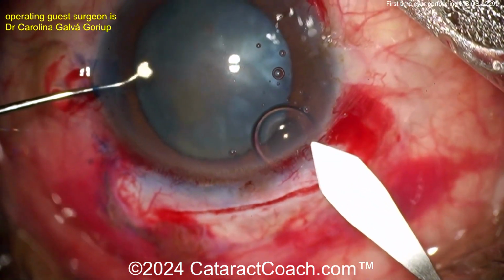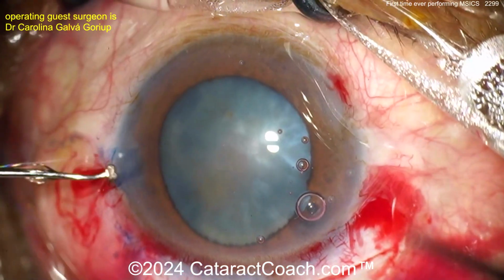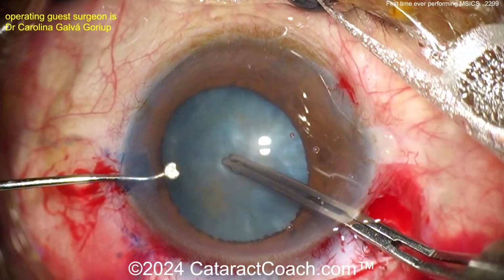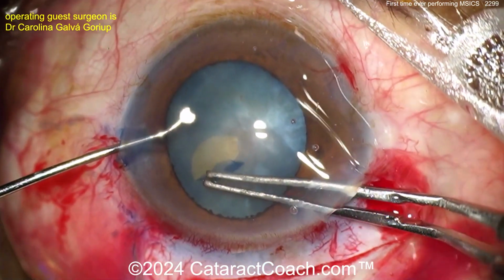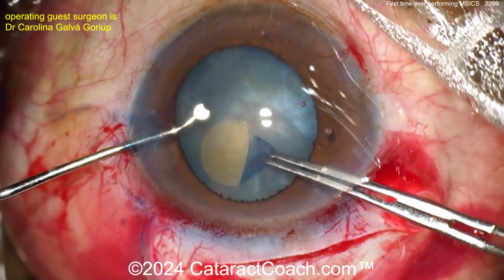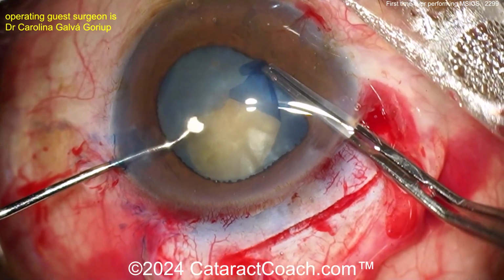Now, here we go. And that's interesting. So I don't know if you really need that extra incision, but that's not a bad idea. If you are more comfortable doing a rhexis through that, that's okay. That's like a phaco-style incision. That's okay. I just do it through the main scleral incision there, but you can certainly do it this way. The angle of approach is a little easier this way.